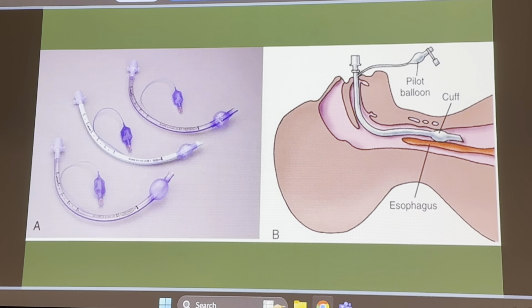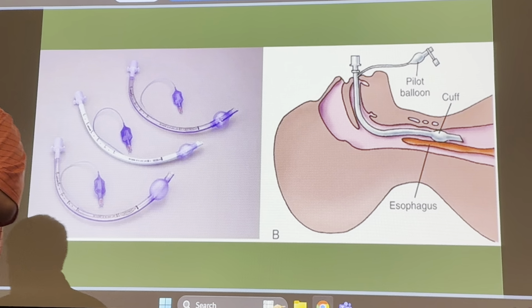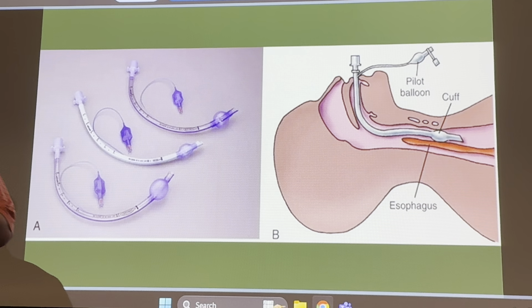Other things, we're gonna tell you for now to not add more air to it. Don't add any more air to it, because this thing could pop, and it also is creating more and more pressure along that trachea, and then we could develop an ulcer because it's something foreign in there pressing up against that trachea right there. And so it's potentially gonna cause a pressure sore. You can talk to respiratory therapy. They can check the levels in here and make sure we have an adequate pressure amount of air, and then they can add another cc or 2 of air.